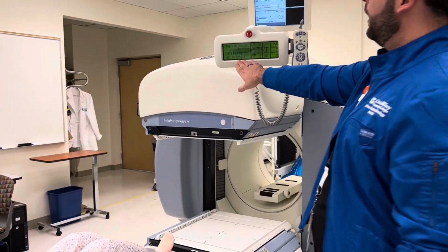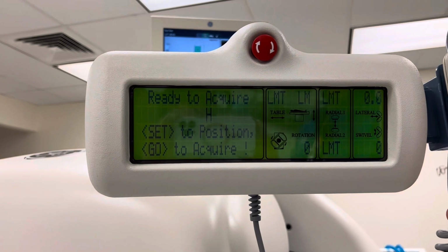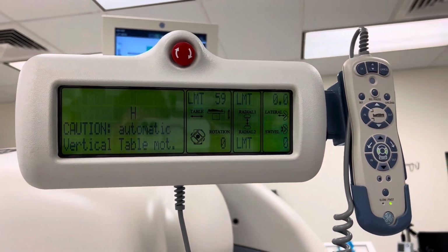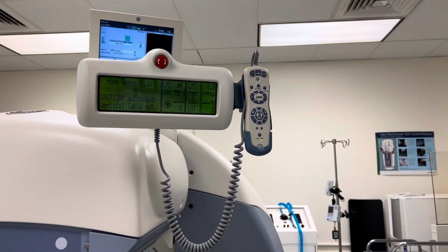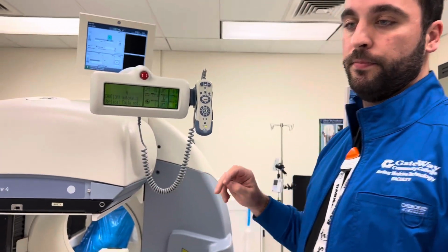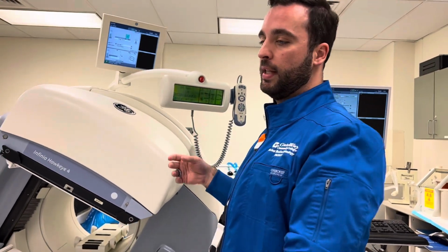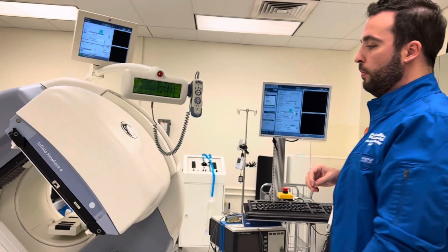So once this populates, it's going to tell you to hit set and go. So we're going to hit enable set. And remember, as soon as you hit enable set, you release. If you hold enable, it'll stop the motion. So the camera's going to rotate to the lateral position for the lateral static of the skull, and then it'll move Rosie in.